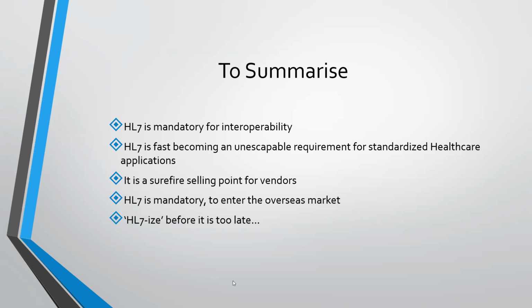We'll take a look at an example of one of the tools as well, so that it would be easy for you. But I would recommend, if you're a beginner, it's better to read through so that it can imprint on your mind and you remember a lot of fields. Do we need to remember everything? Absolutely not. Only the most common fields, because no one can learn and recollect all the fields always, right?